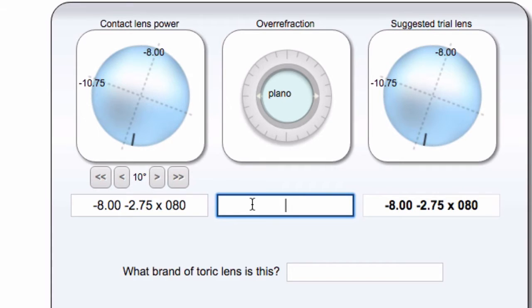The over-refraction works pretty simple, pretty similar, I should say. You just type in the over-refraction. Let's say minus 1 minus 0.75 axis 97 in this case. You can use plus or minus cylinder here, and again, it just puts the powers on an optical cross, and kind of look at how they line up and get a sense of why the calculation comes up with what it does.